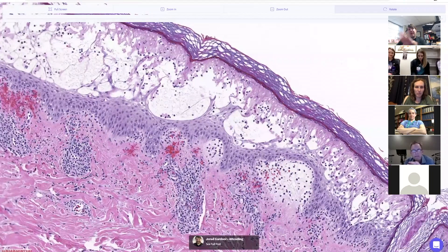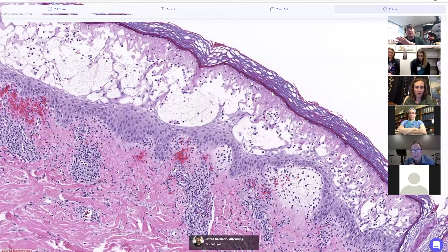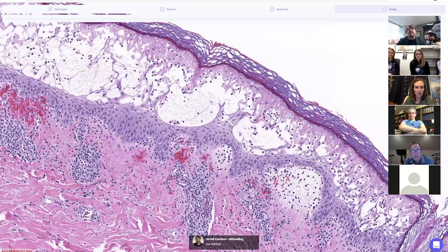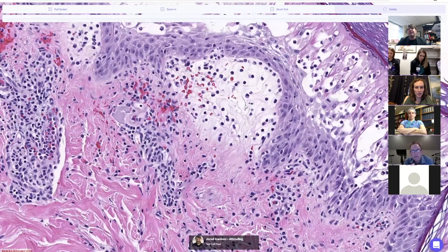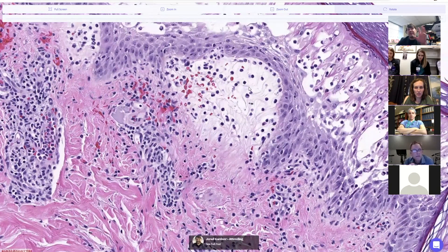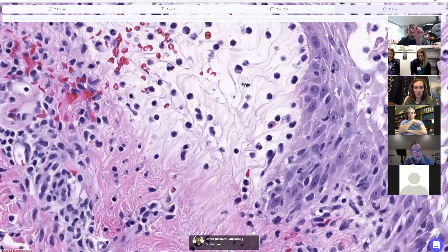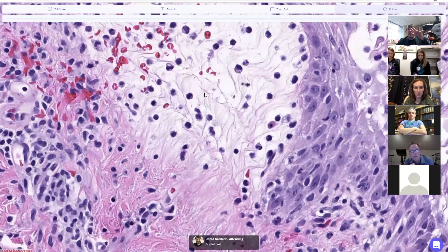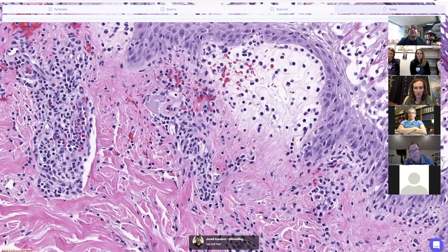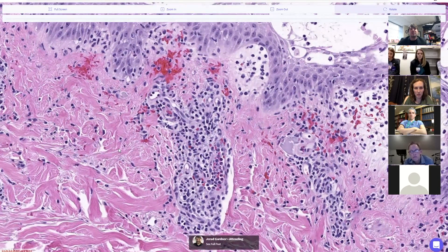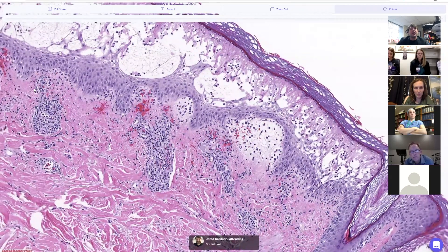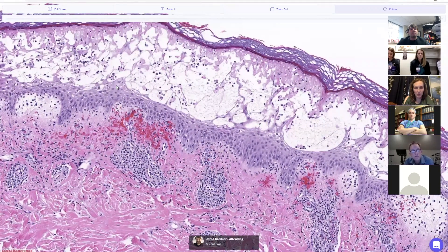Part of the epidermis is intact but the rest is ballooning, swelling, and falling apart with spongiosis. Down in the dermis you get papillary dermal edema — you can really see it here, a very pale papillary dermis because there's so much extra fluid. The little collagen fibers are separated, floating around like strands, and there's hemorrhage around the vessels with perivascular mixed inflammation.